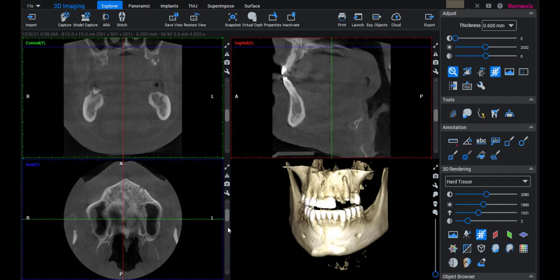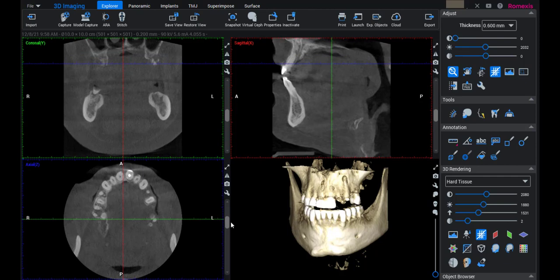Just looking at the apex, you can see tooth number 11 — we've got a break in the cortical plate. Number 7 is very similar. And over here, number 12, something similar — it's broken off.